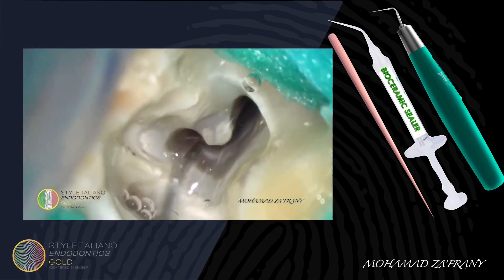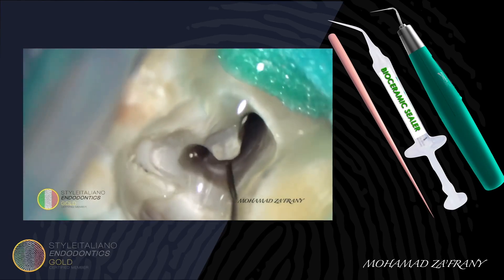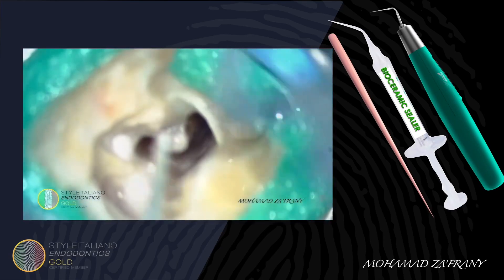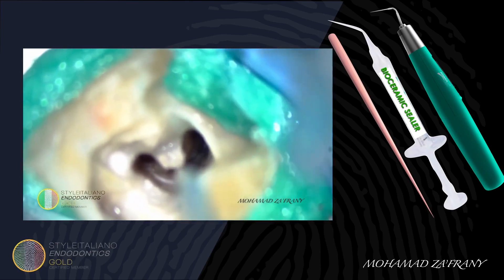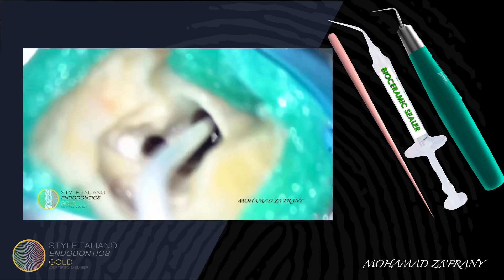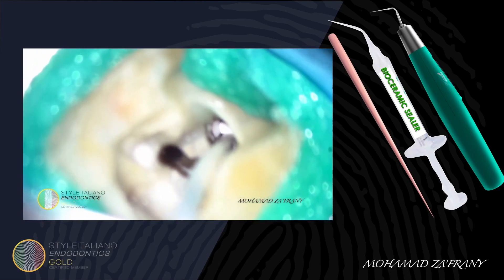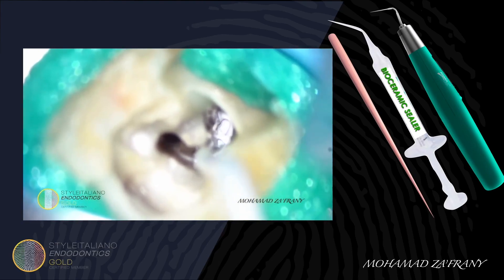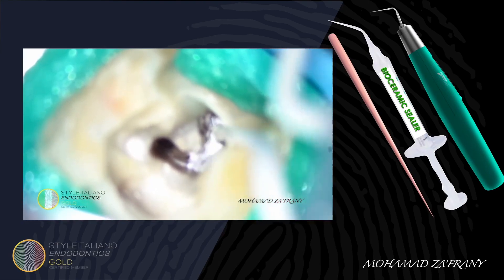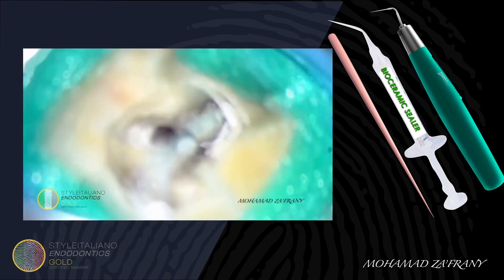After the final flush and drying the canal, I'm placing bioceramic sealer into the canals. Since some moisture may remain in the isthmus area, bioceramic obturation technique is preferred in this kind of case.